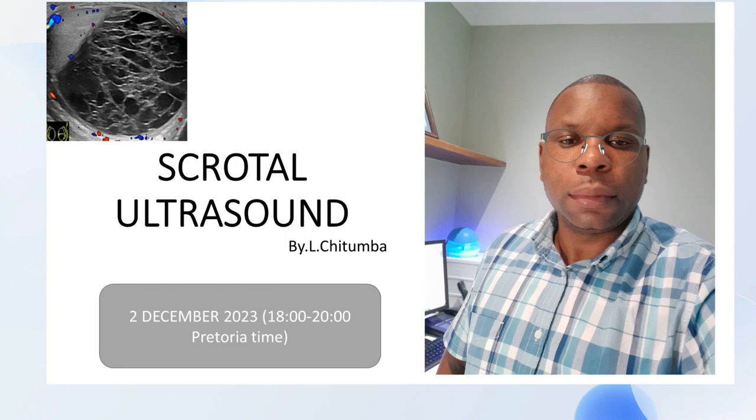Today we are going to discuss scrotal ultrasound. Scrotal ultrasound is one of the basic sonographic examinations that you're supposed to know and do on a daily basis. Why should you know the basics of scrotal ultrasound scan? Because an injury to the testicle can be irreversible and it can cause infertility. So if you are able to do a basic ultrasound scan, you can salvage the testicle before it dies.